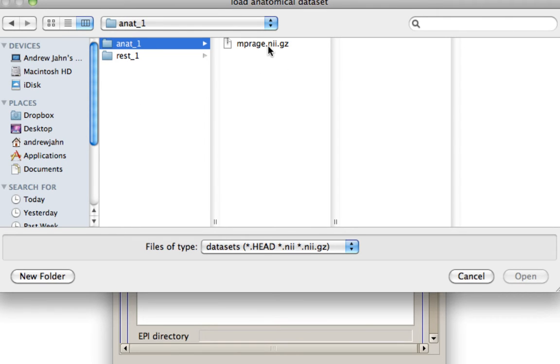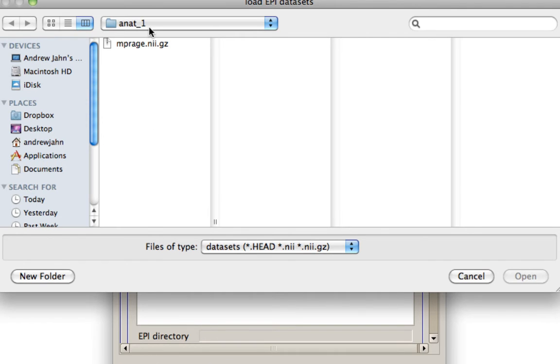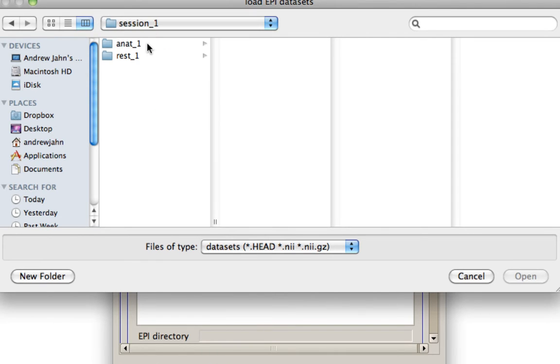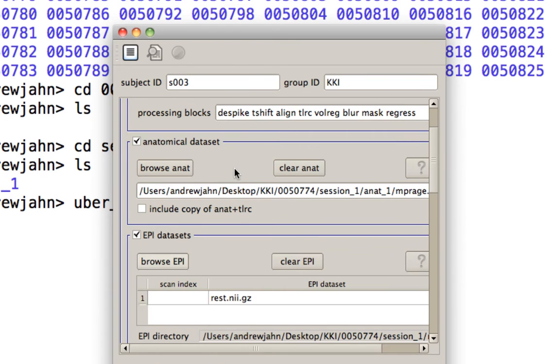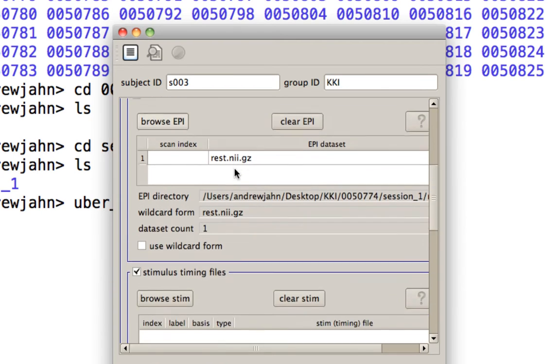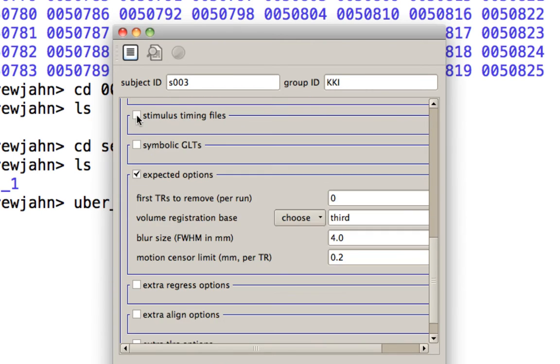For the anatomical, select the thing that's in the anat dataset. And for the EPI, select what's in this resting folder. And really, that's it. So once you have that, and also uncheck stimulus timing files because we're not using any tasks or modeling those.